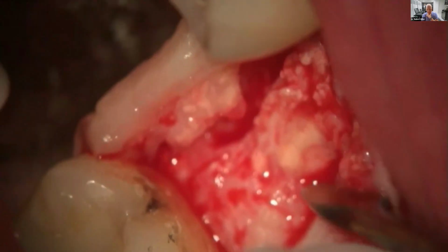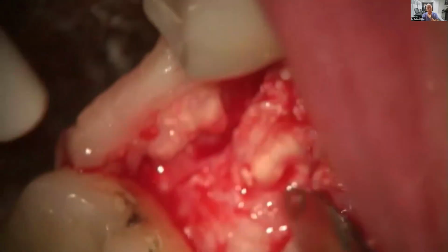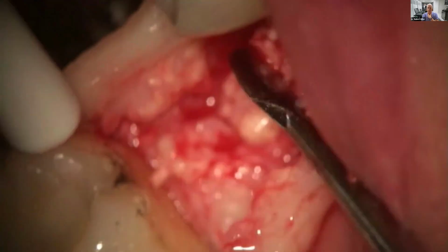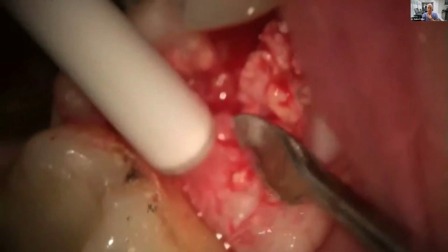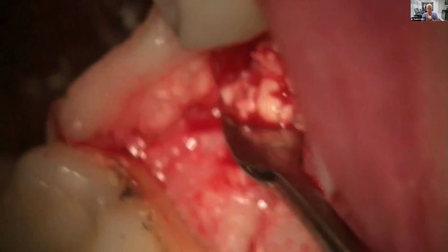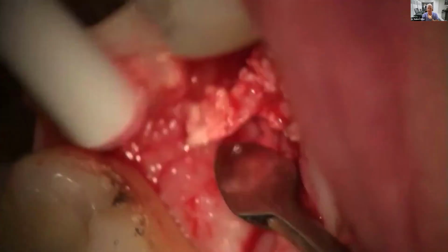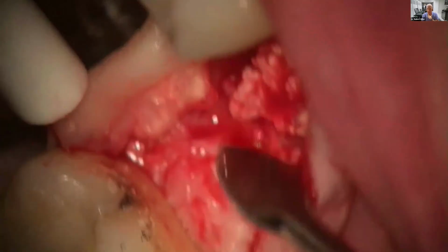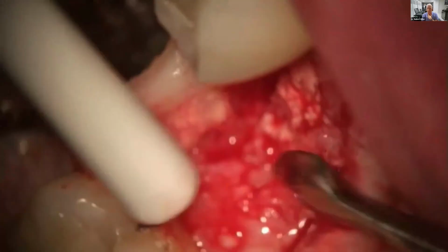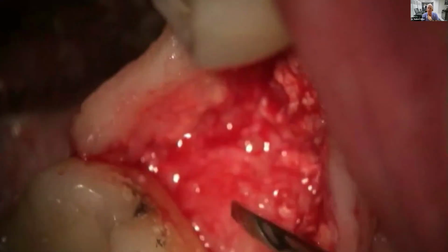Also, one of my cases. Now, in this case, there's no particular graft material left. However, this is not bone. It's somewhere in between, which means that this started the process of becoming bone, but never became bone and left it in a fibrous state. This is called fibrocartilage. This is the precursor to bone, but it never went beyond that because the chemistry of the material was wrong. Perhaps if I waited a little longer, it would have turned into a good stress-bearing lamellar bone.